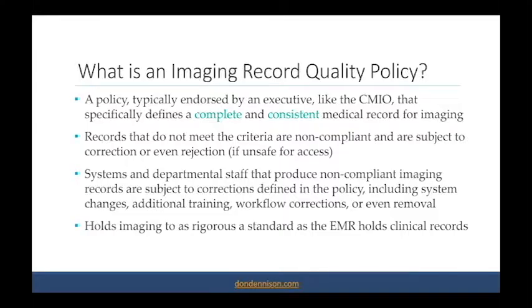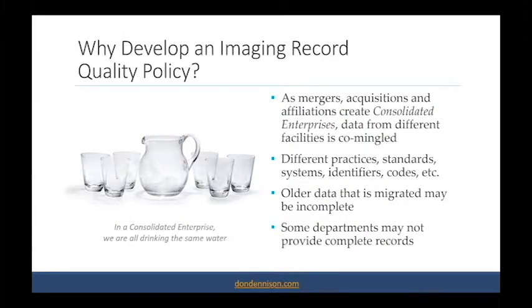Generally in imaging, we've not held ourselves to that same level of rigor. As long as the data came in and it was displayable and the RADs weren't complaining and the report was generated, we were okay. But now, in the era of shared enterprises, we need to think about all that data being shared from all the constituents, including through systems like an enterprise viewer in the EMR. So you have not just dozens or hundreds of people viewing these images, you have thousands or tens of thousands. And with that visibility and transparency, it's very important that we understand all of our work product is to a certain standard.